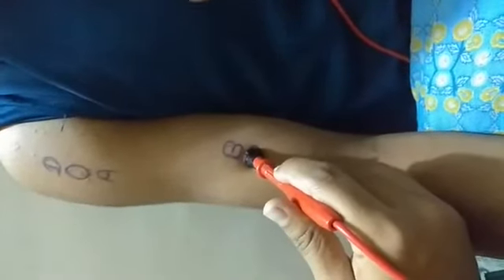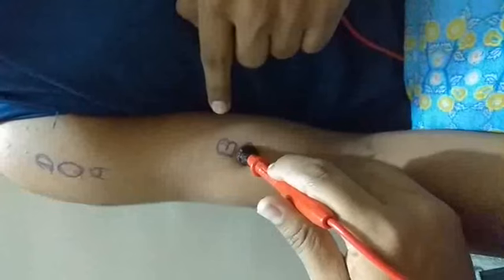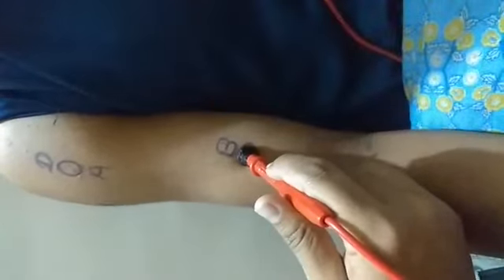The musculocutaneous nerve of the arm supplies the biceps brachii muscle. This is the motor point of the biceps brachii muscle. This is the contraction. Good. The radial nerve supplies the triceps brachii muscle. Triceps brachii has three heads: medial head, lateral head, and long head.